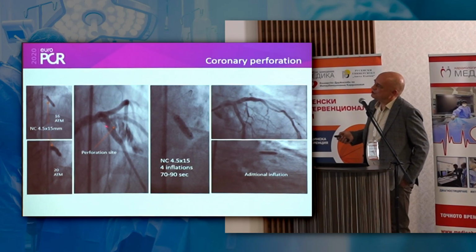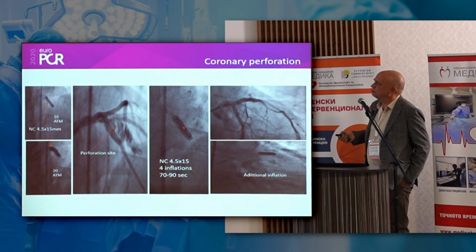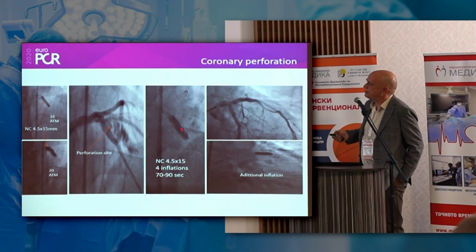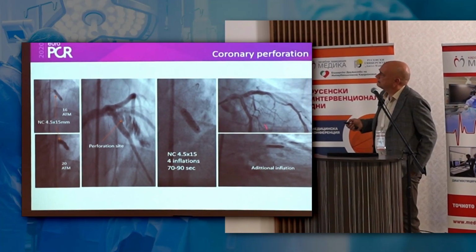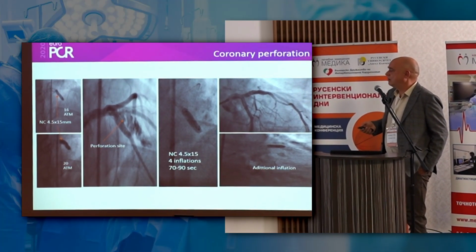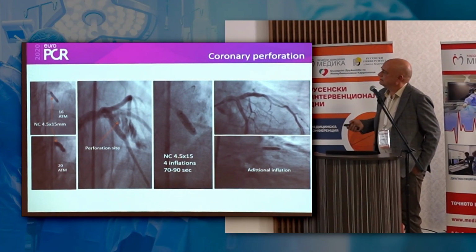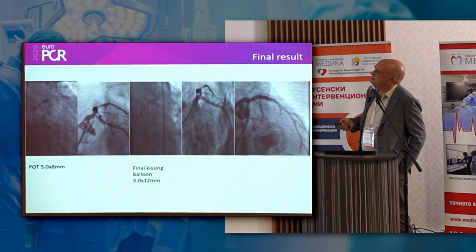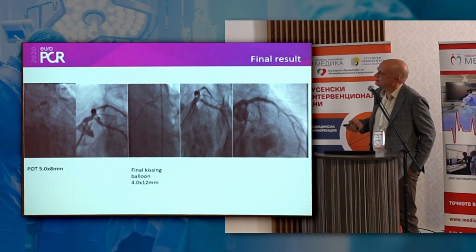So a perforation occurred, which we sealed with prolonged balloon inflations, because our aim was not to put a covered stent in the proximal LAD, and we managed with prolonged dilatation to seal this perforation. Of course, the patient was screaming in pain, but we did it and we finished the intervention. And this was the acceptable final result.